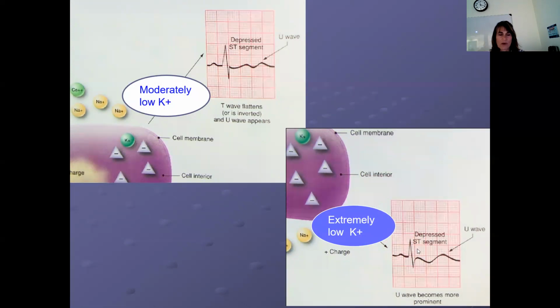So this is supposedly an inverted T wave. And then there's another wave that follows. So another wave is called the U wave. If you've got your T wave and then another wave, they label that U wave. So it's not a P wave? No, a U wave is not a P wave.